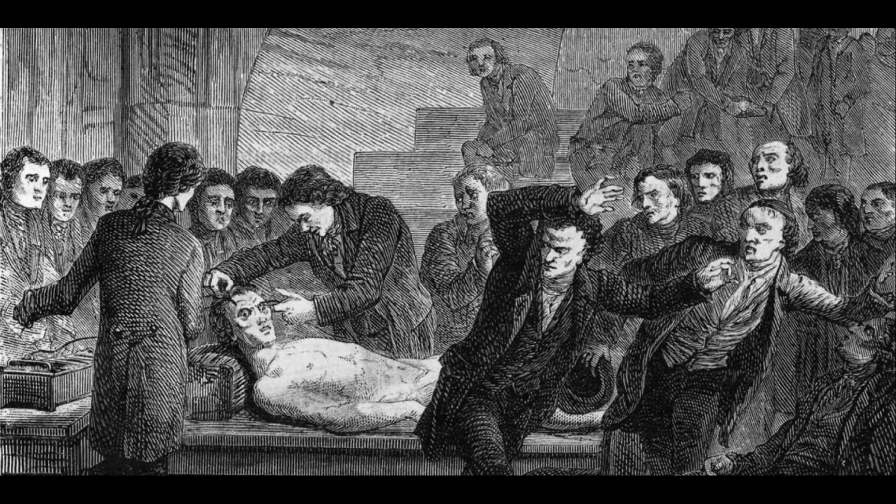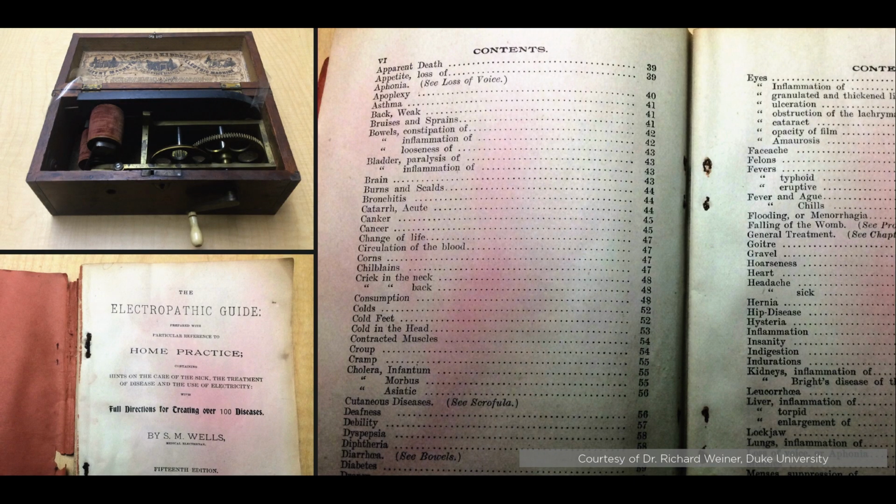And so you can see here a depiction of the reaction of the ordinary folks to the experiments of Aldini. And pretty soon, around the mid-1800s, you have devices that are sold for home use, devices that generate electricity, and it comes with an electropathic guide for home use, and this device can cure everything.